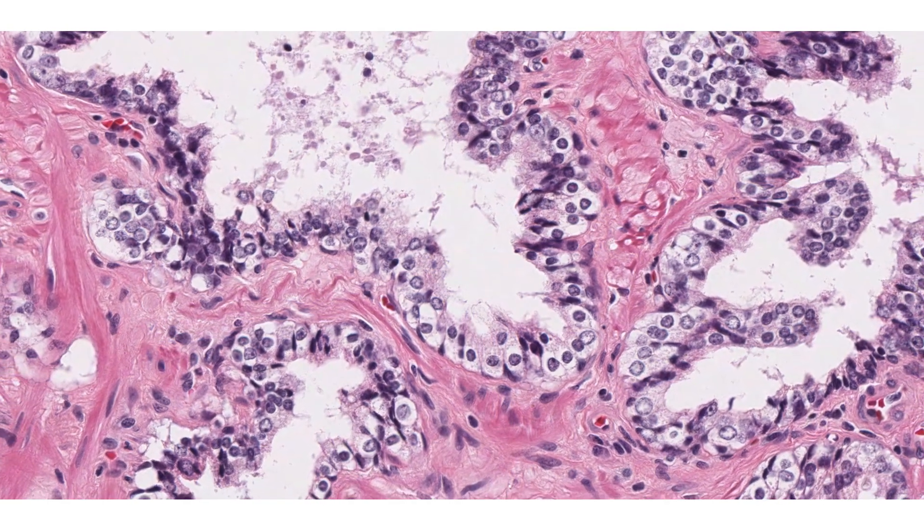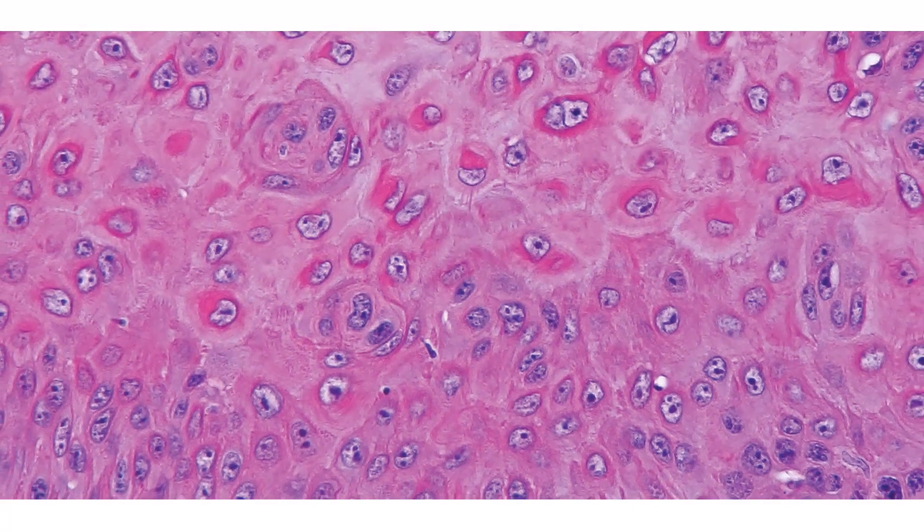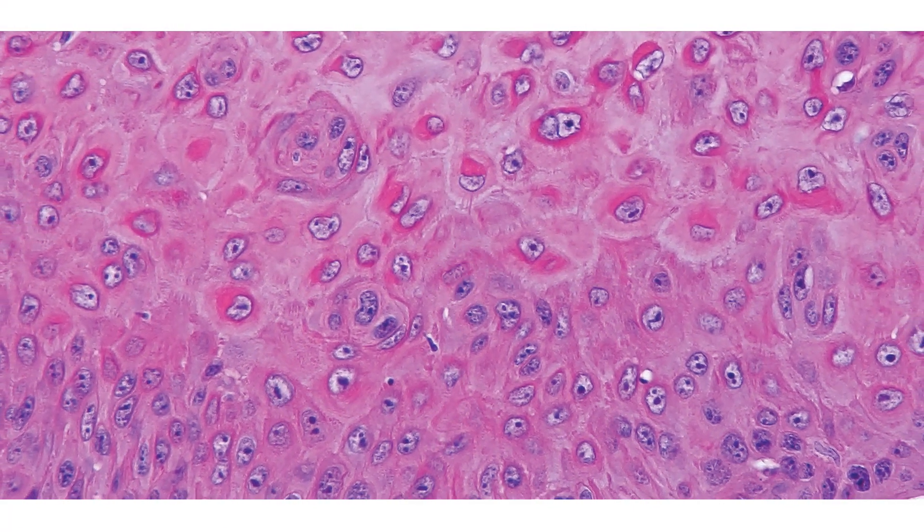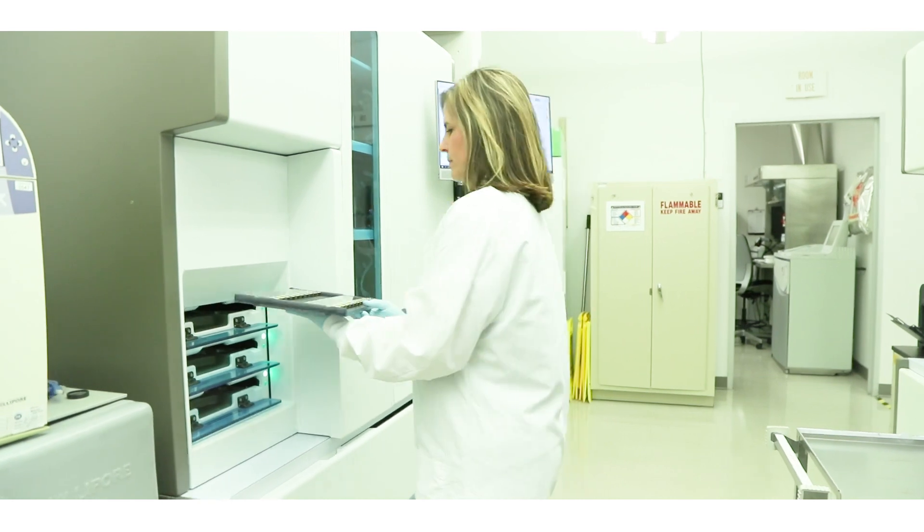Then we'll run what's called an H&E at the beginning and the middle. An H&E is a special type of stain that allows our pathologists to evaluate the material that's there.